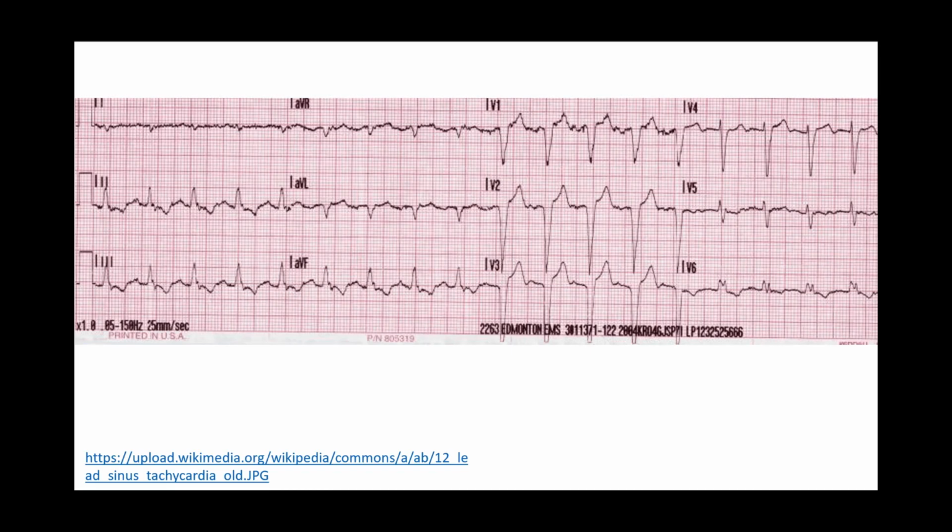Okay, take a moment and try this one out. This one might be a little bit tough to see, but you'll notice that lead 1 is actually a tiny bit negative. Looking closely at the tiny QRS complexes, you'll see that it goes down more than it goes up. So lead 1 is negative here. Lead 2 is positive. You'll see that it's definitely going up. And AVF is positive as well. It's definitely going up.